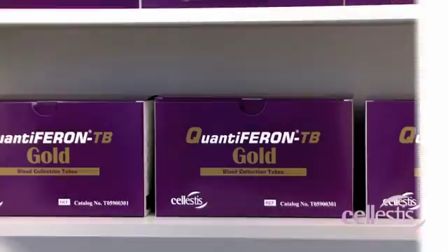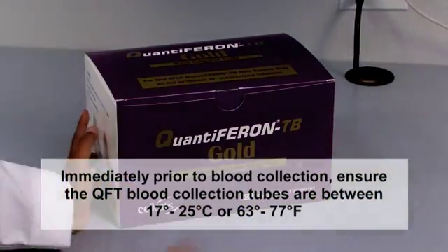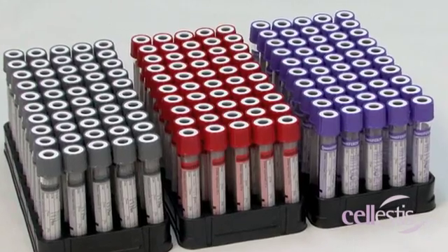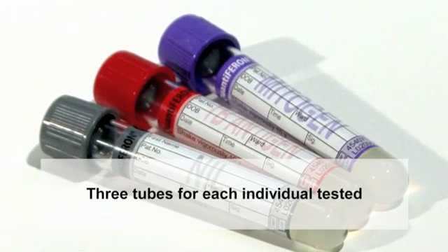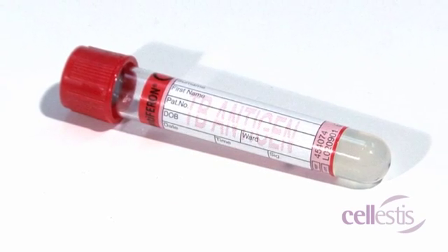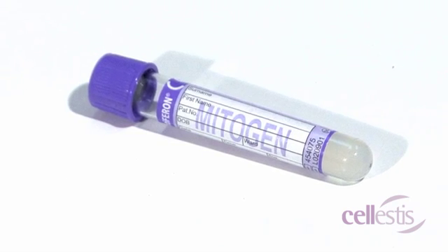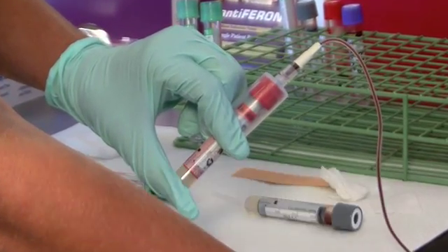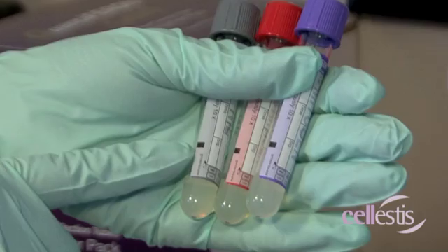Immediately prior to blood collection, ensure the QFT blood collection tubes are between 17 and 25 degrees Celsius or 63 and 77 degrees Fahrenheit. The QFT system uses specialised blood collection tubes that contain antigens or controls. Each test includes three QFT blood collection tubes: the nil tube with a grey cap is the negative control, the TB antigen tube with a red cap is coated with TB specific antigens, and the mitogen tube with a purple cap is the positive control. Each tube is manufactured to draw one milliliter of blood and performs optimally within the range of 0.8 to 1.2 millilitres. The black mark on the label indicates the one milliliter fill volume.